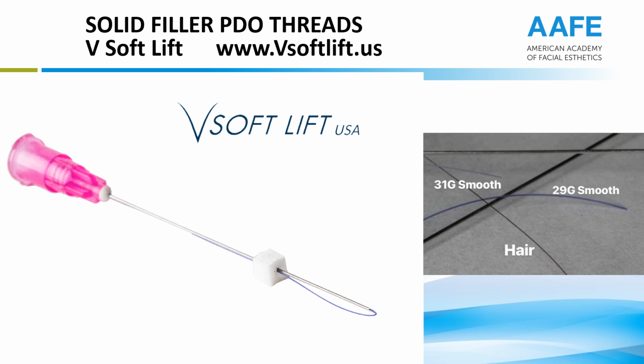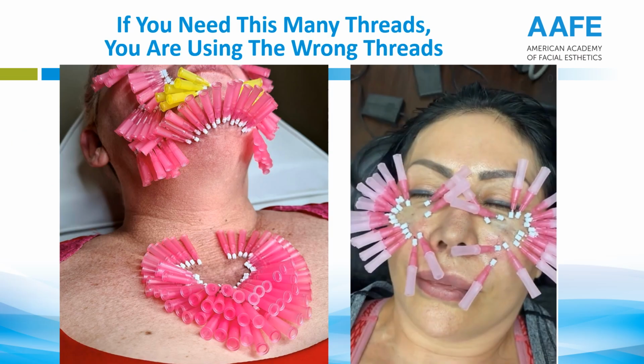They more slowly break down. What that means is more collagen biostimulation, and that is why you need so many fewer smooth PDO threads for V-Soft Lift than you need some of the other ones, because this is going to be pure collagen biostimulation. We're going to go back to that patient and see exactly that.